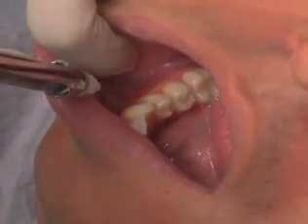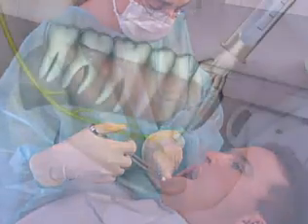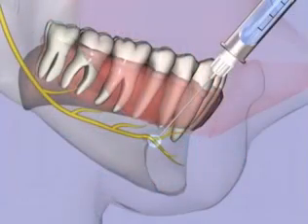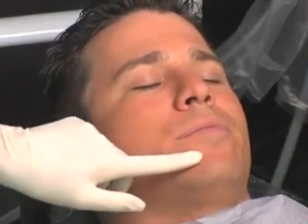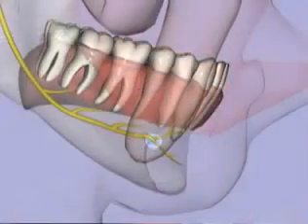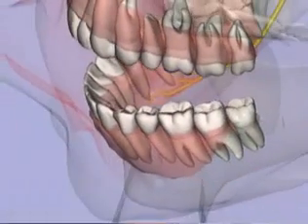Following 2 negative aspirations, 1/3 of a cartridge of anesthetic is deposited over 20 seconds. The syringe is removed and pressure is applied extraorally or intraorally, forcing local anesthetic into the mental foramen, blocking the incisive nerve.